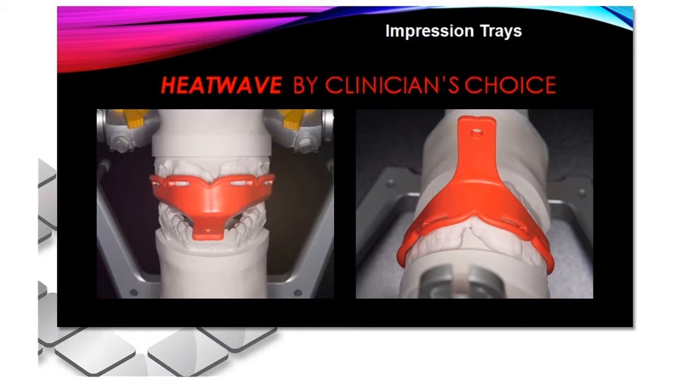This is hands down my favorite tray of choice. It is almost impossible to miss an impression because of the accuracy of these and the minimal amount of material used, and it forces material up into the sulcus and around the teeth. Now, granted, based on how deep your margin is, how floppy the tissue is, it may not go as far as a couple millimeters, but I can tell you there are plenty of times where I can force material under the gum line when I have healthy tissues and a lack of bleeding.